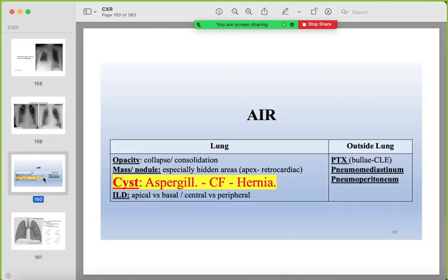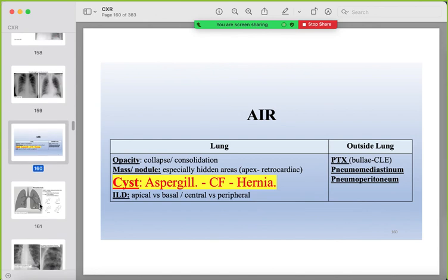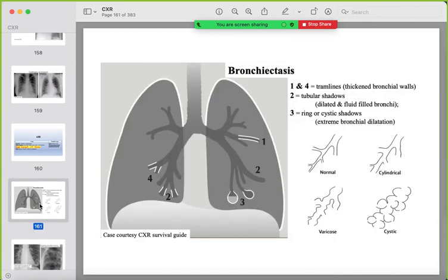Cystic lung changes: bronchiectasis has multiple types — tram lines (cylindrical), ring or cystic changes, and tubular changes.